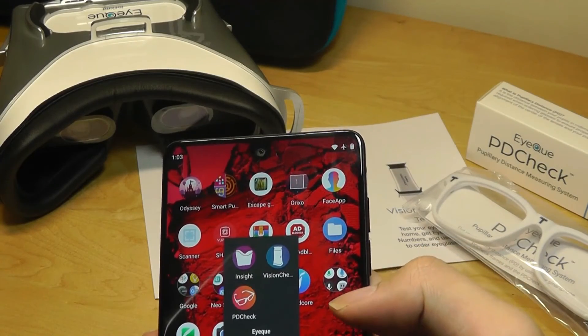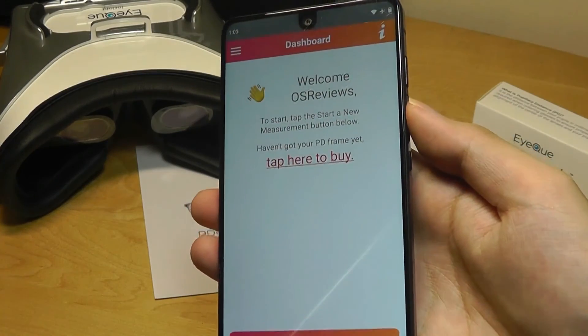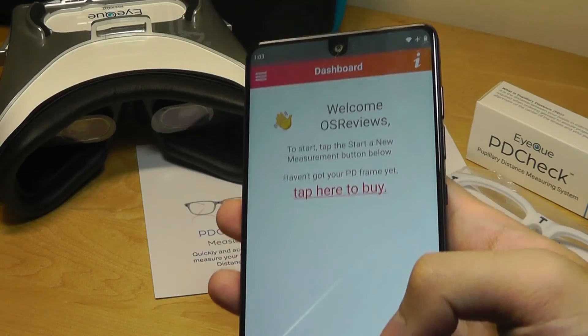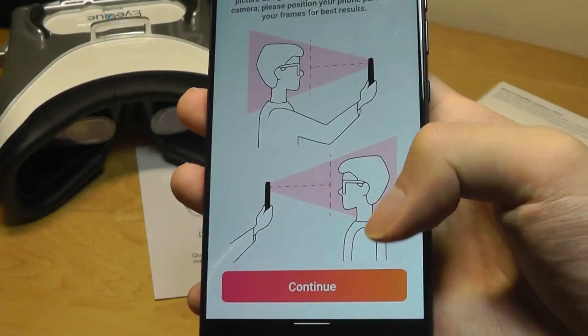Finally, with the PDCheck, there's a separate app. This is the simplest of the three: it uses augmented reality and your front-facing camera. You raise the glasses to your face, capture an image, and then it scans and processes it to give you your pupillary distance measurement.